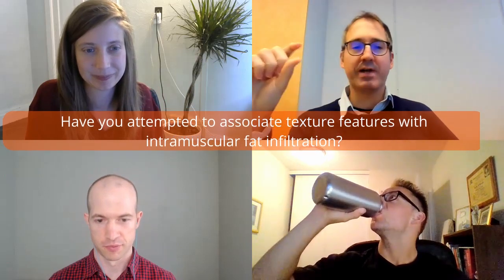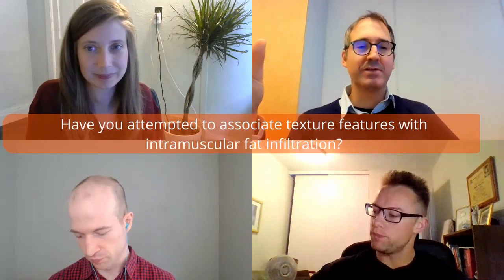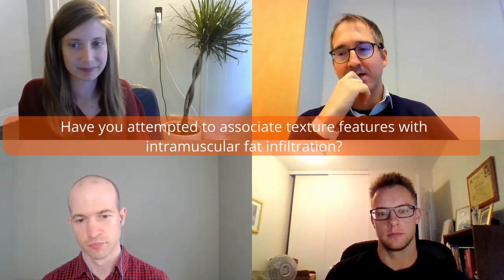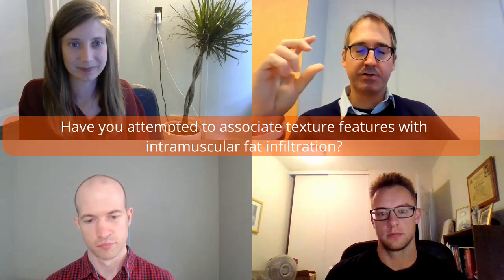I was wondering, Mike, if in that study, or maybe you did, you already tried to make an association between some texture parameter and fat infiltration, for example. At least for what I'm studying, it is really interesting to discriminate the portion of fat infiltration. The gold standard is the MRI Dixon technique, which is definitely a great technique, but if you can do the same with ultrasound, it will be easier, day-to-day applicable, and less expensive. So that is also my dream, to extract this parameter with ultrasonography.